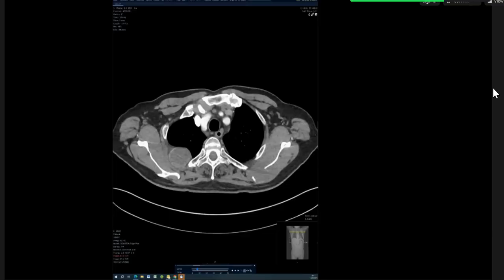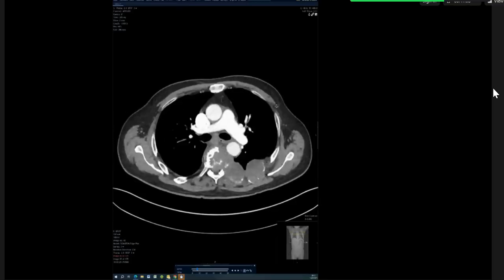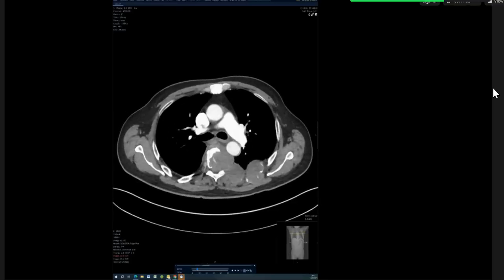So next I would request a CT abdomen and pelvis. I would refer this patient to the urology team. With the CT abdomen and pelvis, I would probably like to do a triple phase scan, so a urogram, just to assess the renal tract and exclude involvement. Refer to the MDT urology review, and potentially a biopsy could be taken, and potentially from one of the soft tissue lesions in the bones.